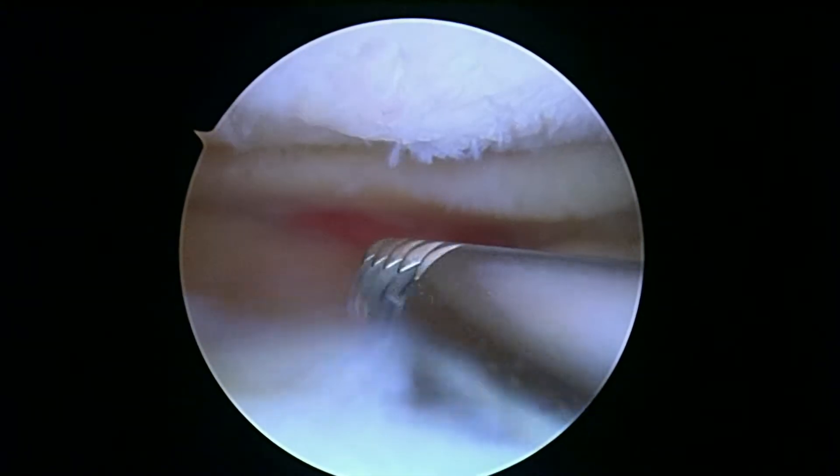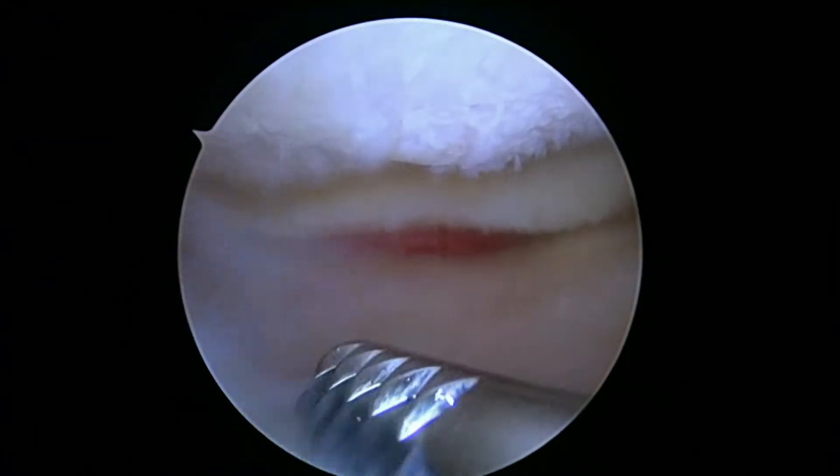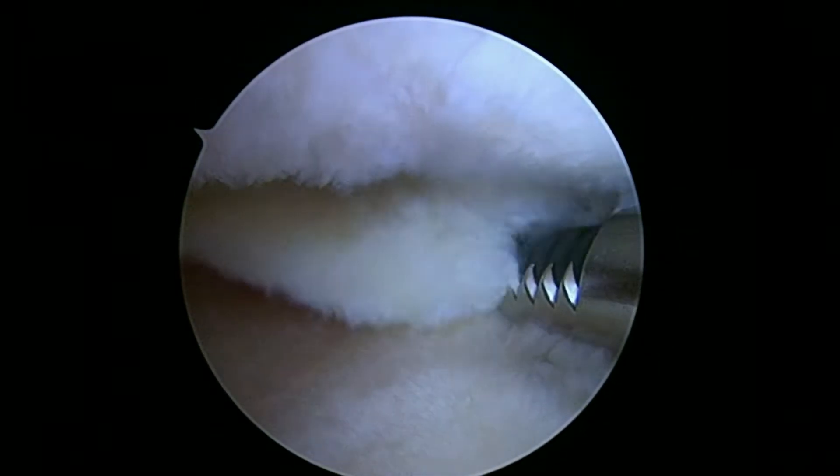So we'll keep working here. I'm going to start on the anterior horn so we can clear a space so we can see really well here. You can see up above, if you look at the femoral condyle, it's not quite normal either. Okay, we'll keep working here, I'll show you some more in a little bit.